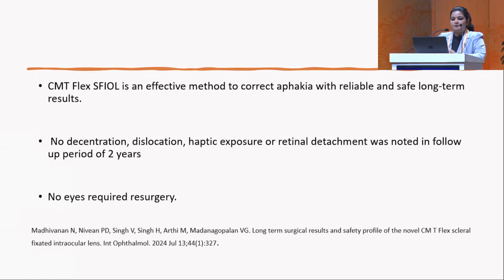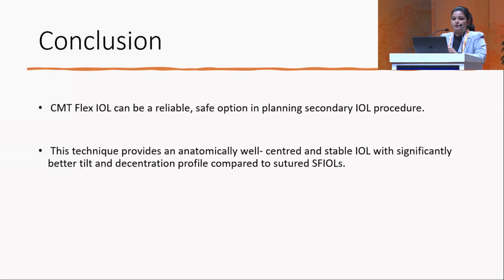A study conducted by Nivian showed that the CMT flex IOL is an effective method to correct aphakia with reliable and safe long-term results. There was no decentration or any dislocation, haptic exposure or retinal detachment noted for a follow-up period of 2 years. No eyes required any resurgery. Conclusion: CMT flex is a reliable, safe option in planning secondary IOL. This technique provides an anatomically well-centered and stable IOL with significantly better tilt and decentration profile compared to sutured SFIL.